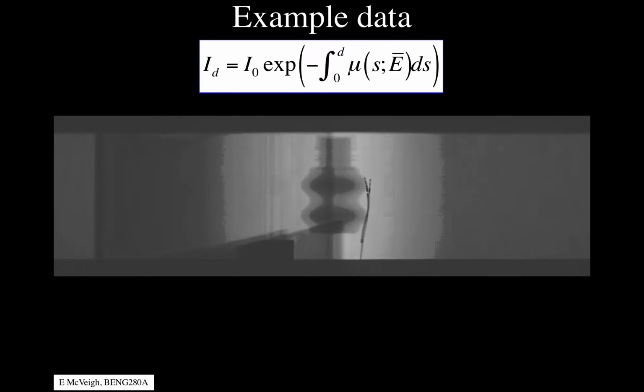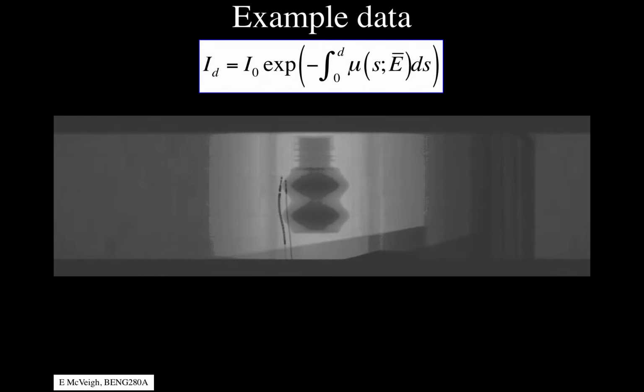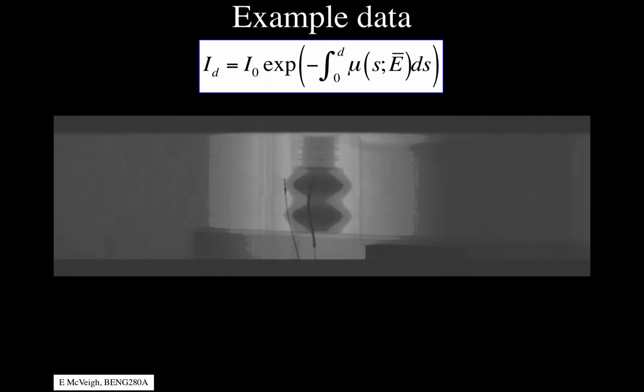Now, this data is not corrected at all, in terms of correction for the intensity of the emitted radiation, or for the difference in amplification on the different detectors and things like that. This is just what came out of the scanner. It's pure raw data. But this gives you all the views that are sufficient to reconstruct the object.